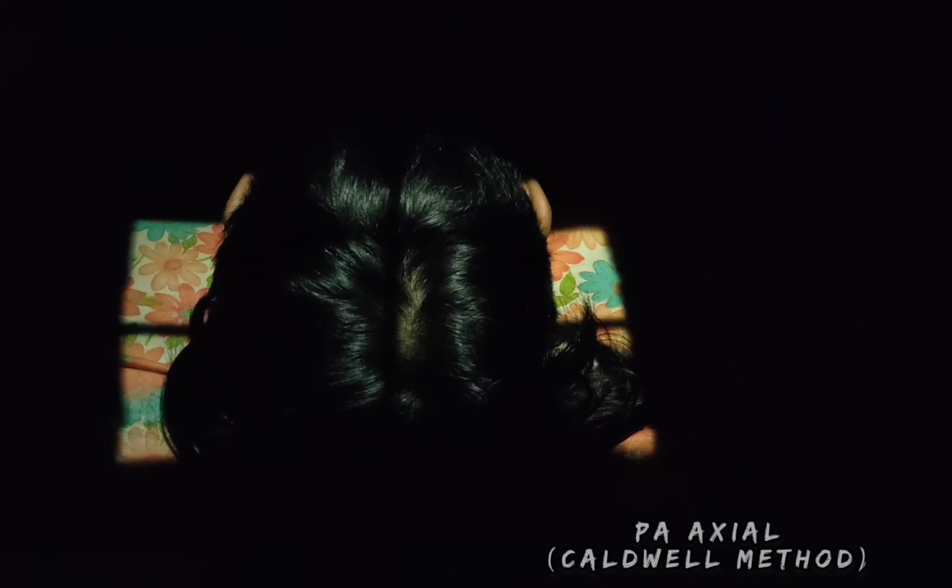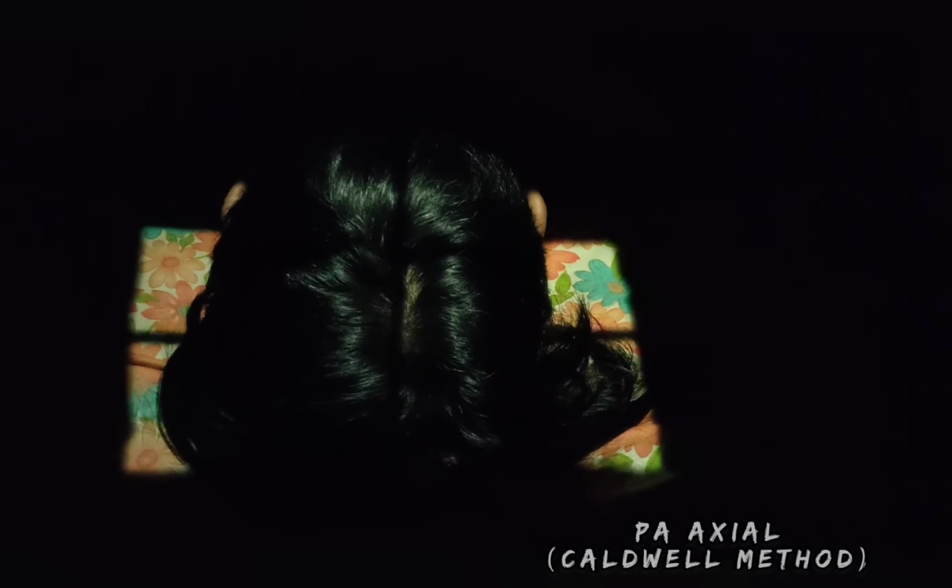PA axial projection, skull or Caldwell method. Patient position must be erect or prone. Then part position: align the MSP perpendicular to the midline of the grid or table. Align the OML perpendicular to the IR. Then prevent head rotation or tilt. CR: angle the CR 15 degrees caudad and center to exit at the nasion.